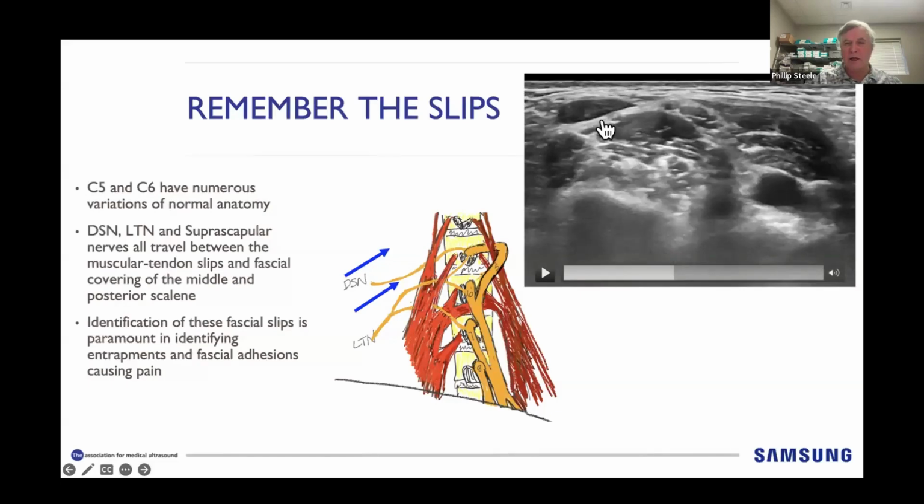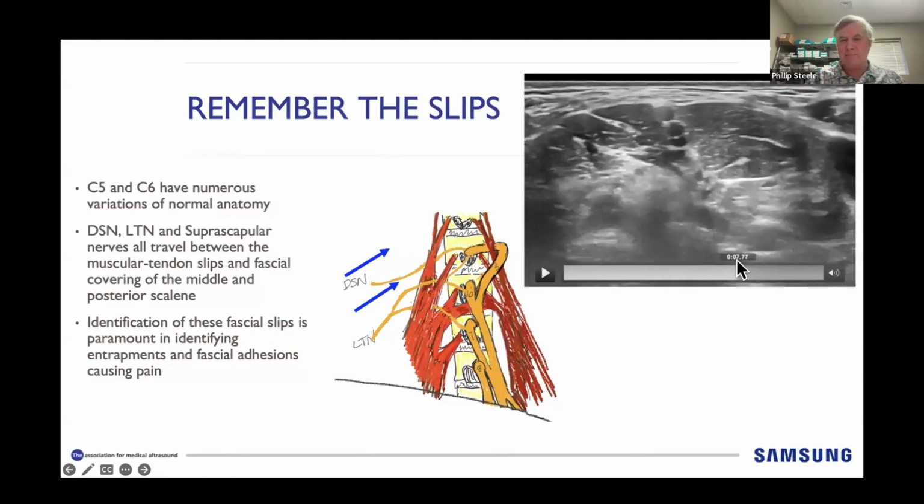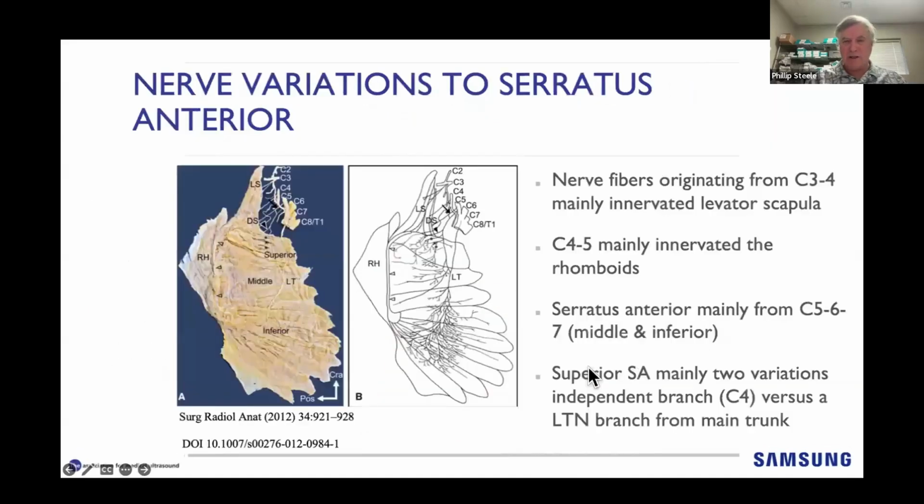So once they all join, when it leaves late, that's the long thoracic nerve to the first serratus anterior off the first rib. And then this is going to head down to form the C6 and C7 contribution. That is not dorsal scapular nerve, okay? And we'll show that in a minute.